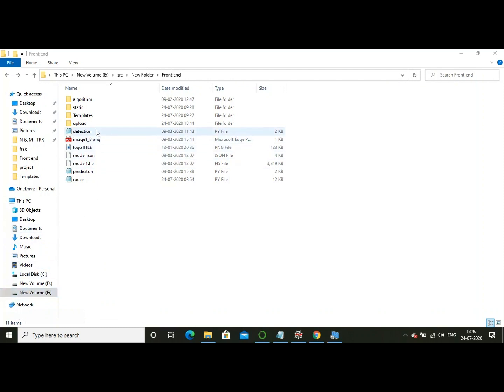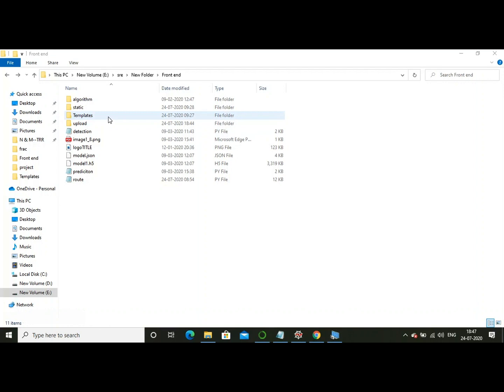As you are able to see, this folder consists of items that are related to Flask. It means that we are deploying this CNN algorithm into a web application through which we are going to check whether an X-ray image is fractured or not.